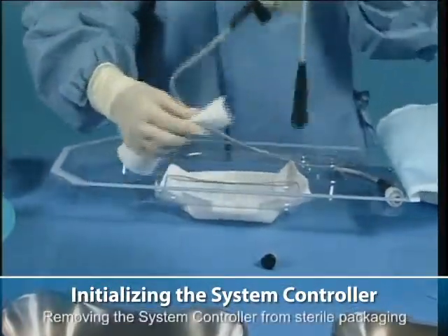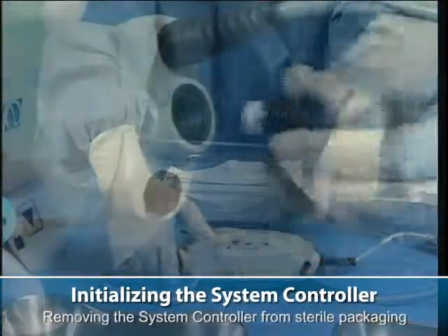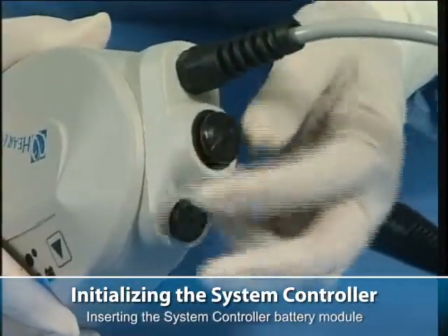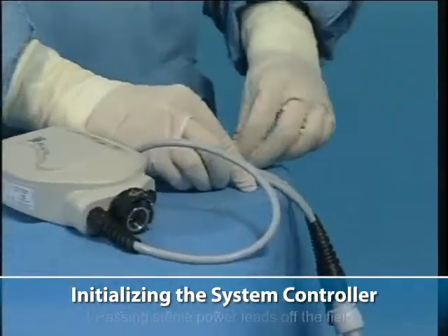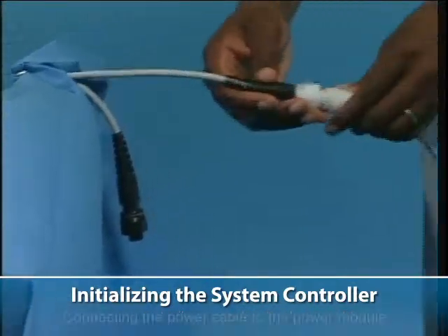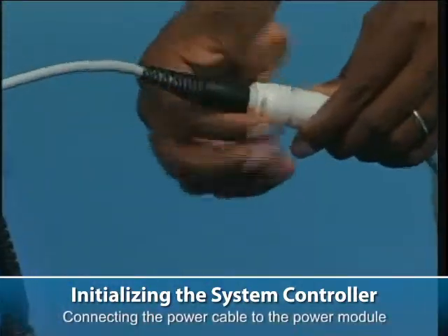Removing the system controller from sterile packaging. Inserting the system controller battery module. Passing sterile power leads off the field. Connecting the power cable to the power module.